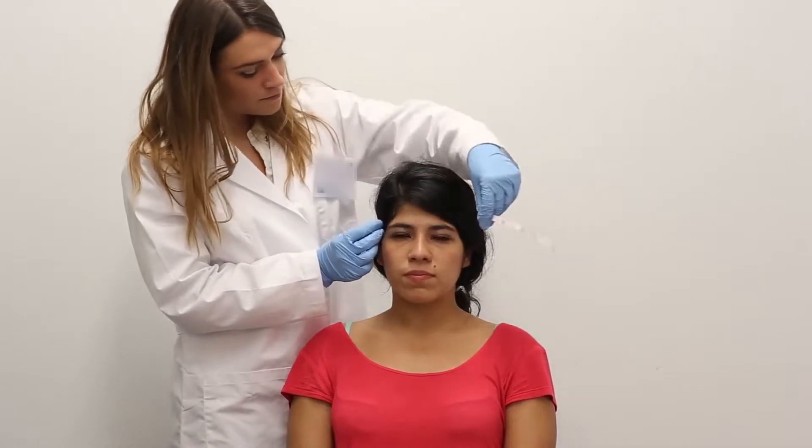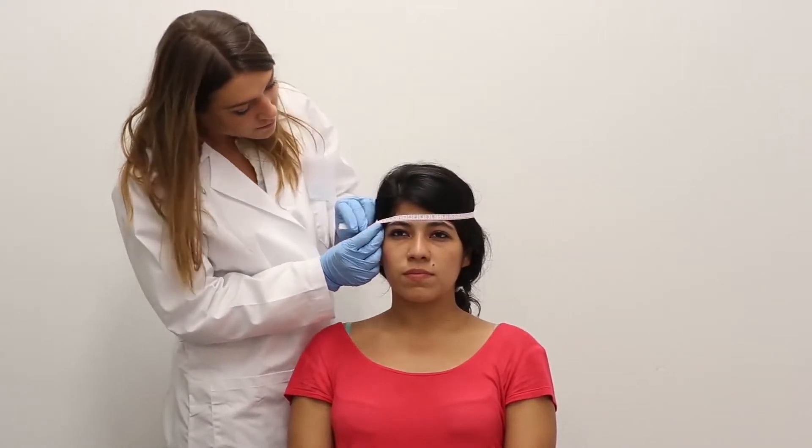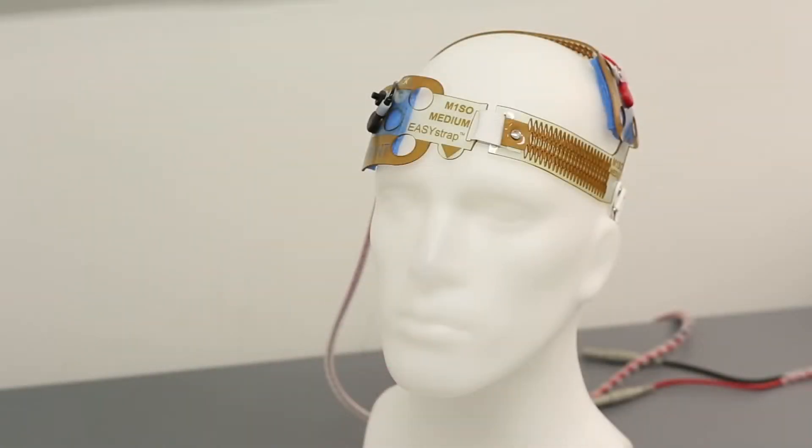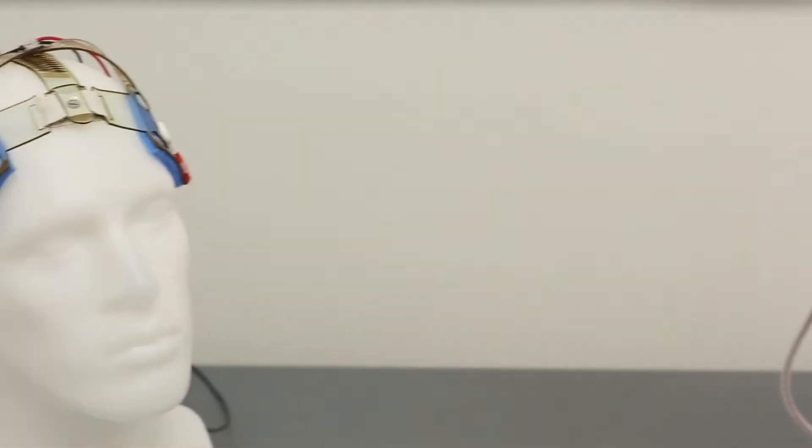Setup begins by first measuring the subject's head circumference to determine the appropriate size of the headgear to be used. There are different sizes of headgear depending on the electrode montage.